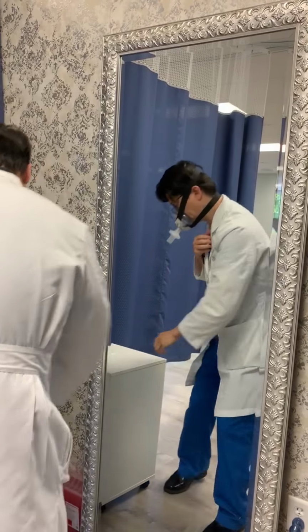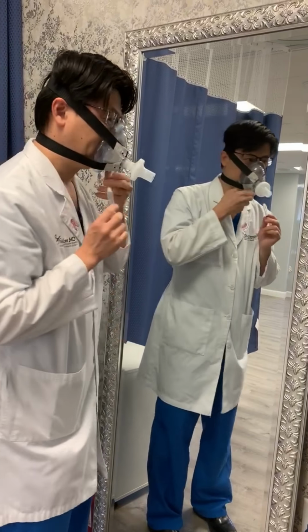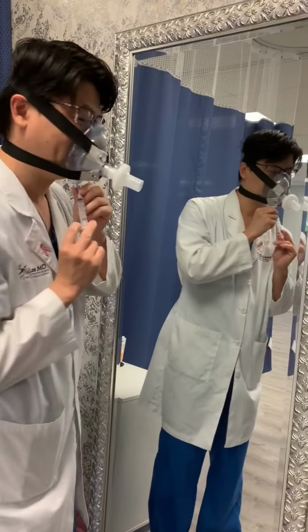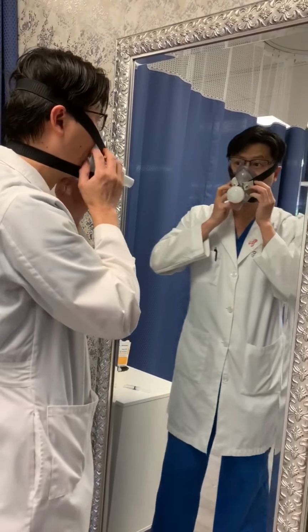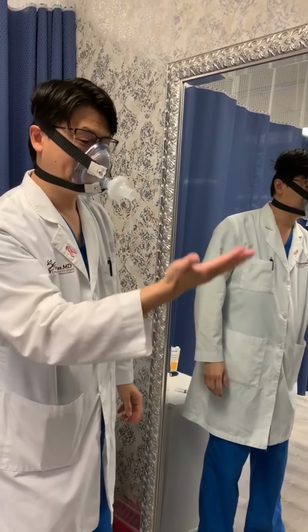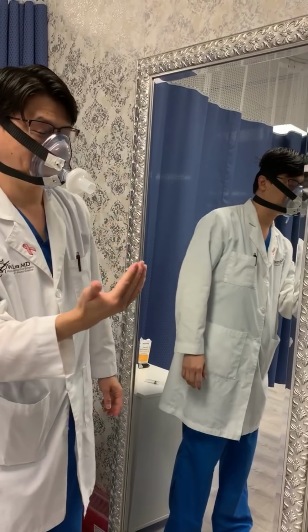Here's a 5 cc syringe. If you need to add air or subtract air to make a better seal, you can do that. Now you want to do a leak test. If you put your hand over the filter and take a deep breath in, you shouldn't be able to bring in any air.